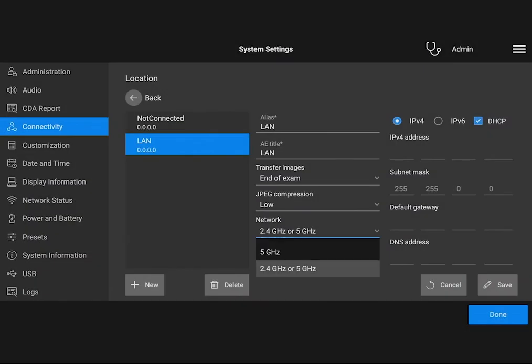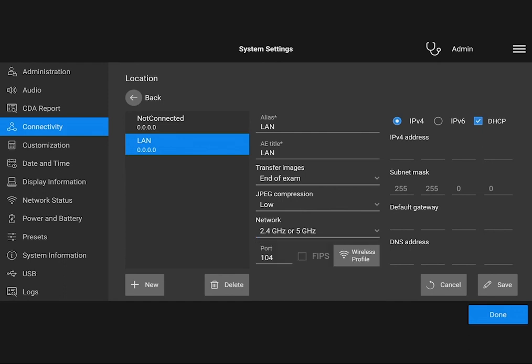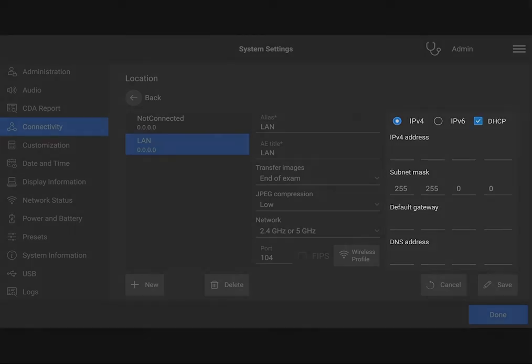If you have issues exporting your data, check your DICOM and export settings. For example, check the IP address, AE title, and port number.